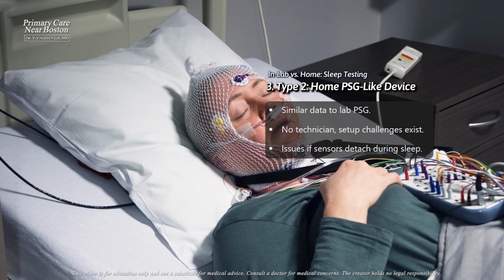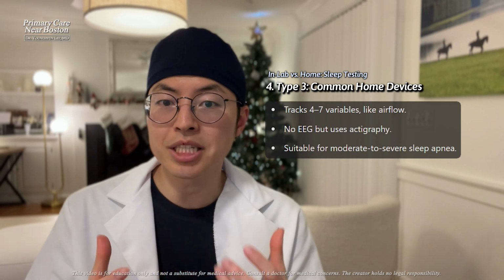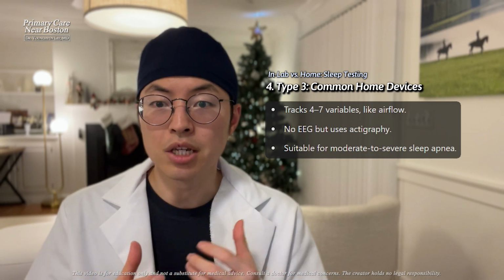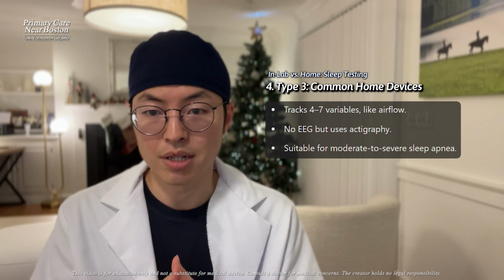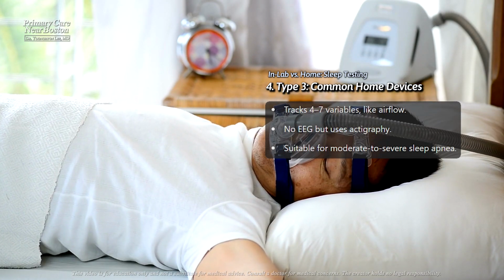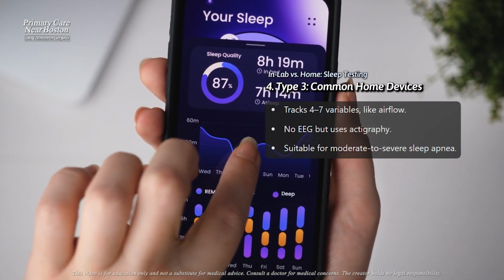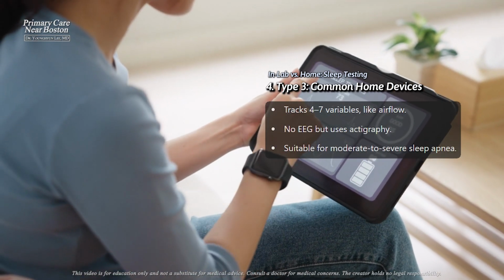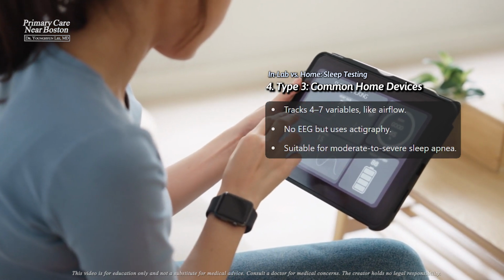sensors detach during sleep. Type 3 devices, the most commonly used home sleep apnea testing devices, monitor 4 to 7 variables, including airflow, respiratory effort, heart rate, and oxygen levels. Some models may even track snoring, body position, or movement. While they don't measure brainwaves, EEG, which means they can't monitor sleep stages, newer devices may use actigraphy, a motion sensor that estimates sleep and wake times, to help fill this gap.